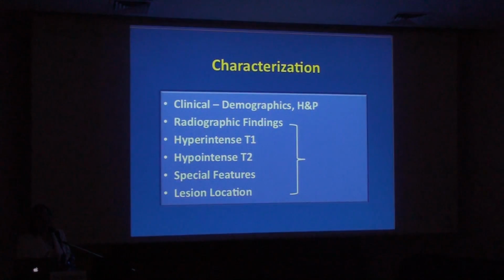So the most important thing perhaps is to start with the clinical information. What are the demographics of the individual? Because certain diagnoses are going to be more predominant in younger people, certain diagnoses more predominant in older people, and may differ from men to women.